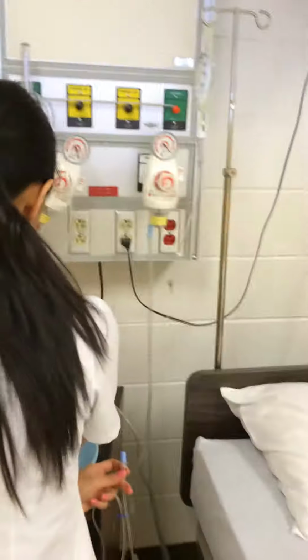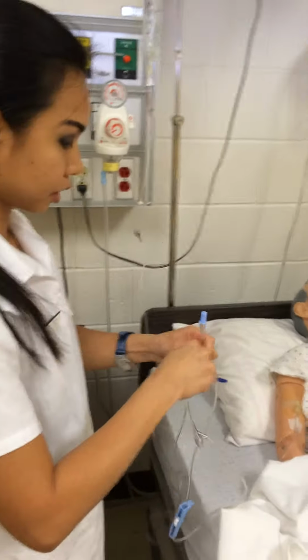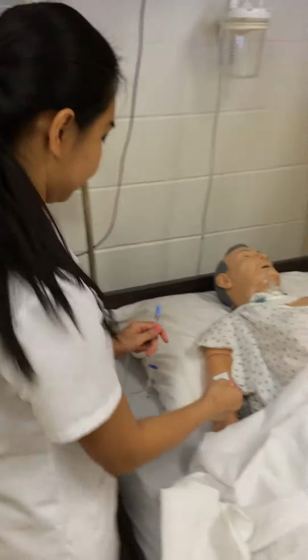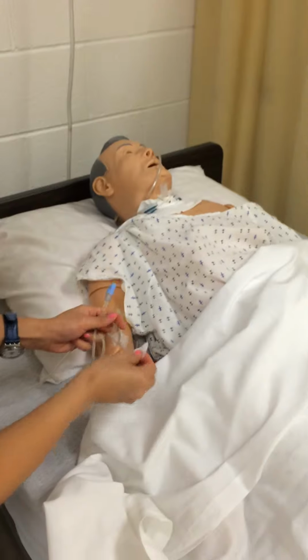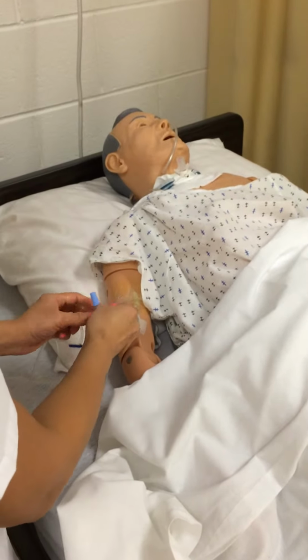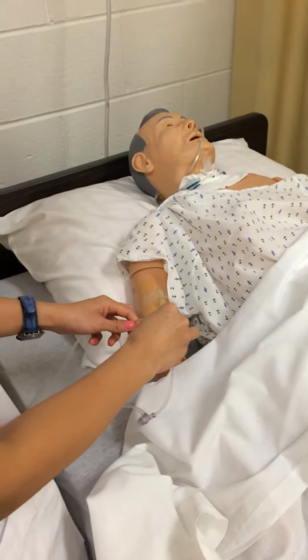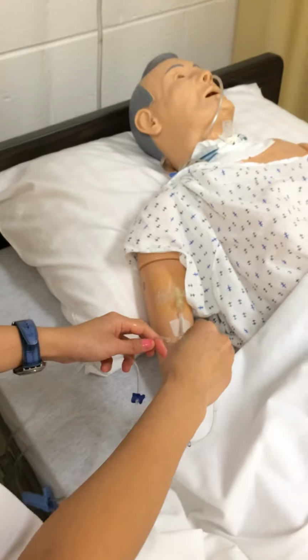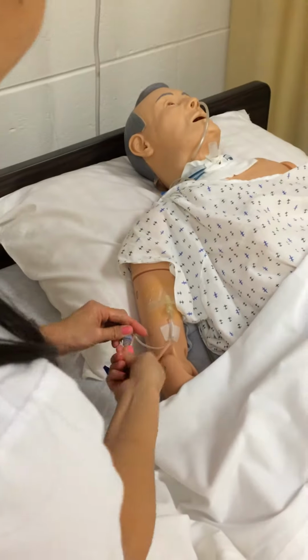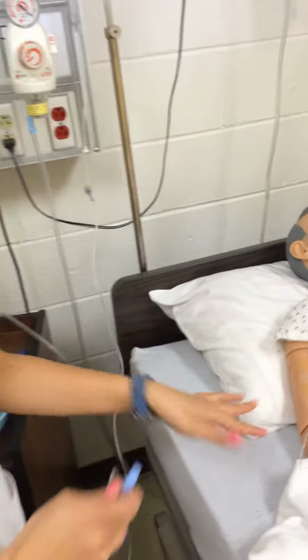Okay, so before I give the IV to the patient, I make sure I clean the site first, the heparin lock. Clean. I open it and I connect the IV to the heparin lock. So because this is validation, I'm not going to put it in the reel because it's going to wet the bed.